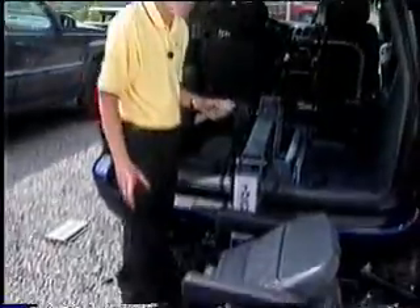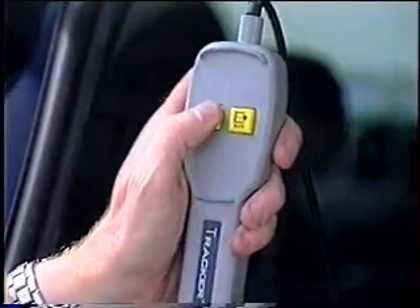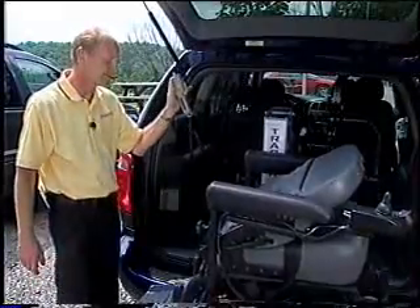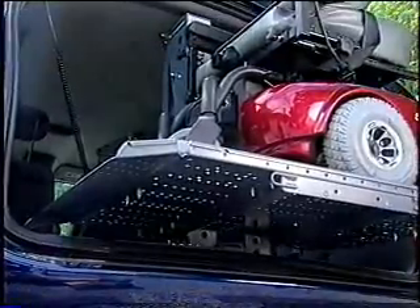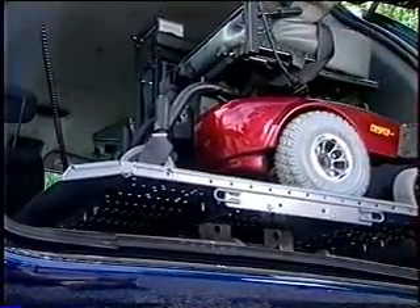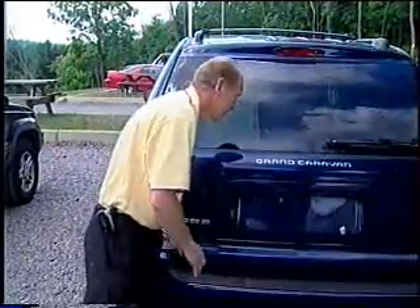All the customer has to do is put their power chair on the platform onto the electrical docking lock. The green light will be lit showing the docking lock is secure. They push the end button, the platform goes up in the air and into the vehicle. And they're done.